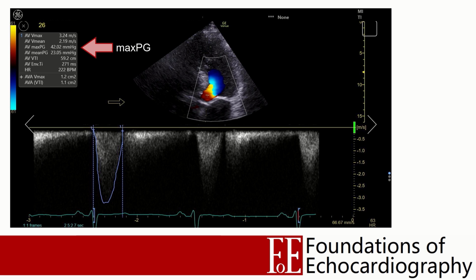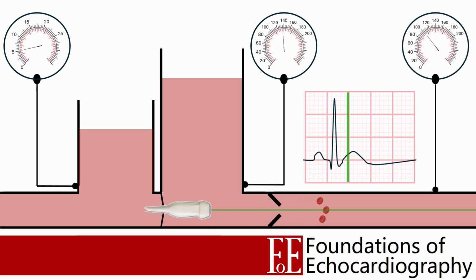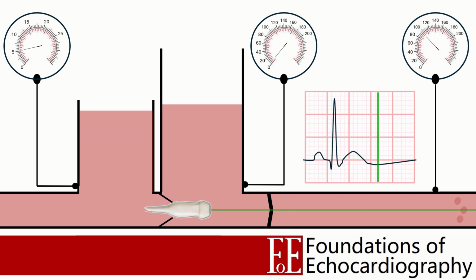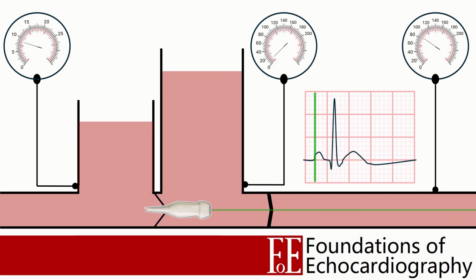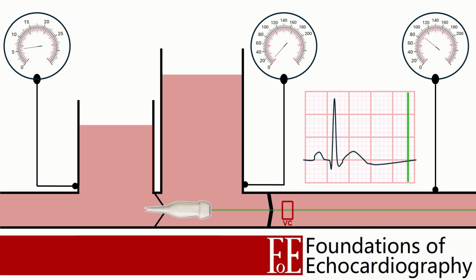Now there's a number of important reasons for this, and we're briefly going to detour to look at two of these. First, this can occur due to a phenomenon we discussed earlier, namely pressure recovery. Echo estimates of velocity and hence pressure are made from a point of maximum velocity, which is the vena contracta. This point, where the blood is travelling most quickly, occurs just beyond the leaflet tips. As the blood passes through the stenotic valve, it continues to accelerate momentarily before starting to slow down.